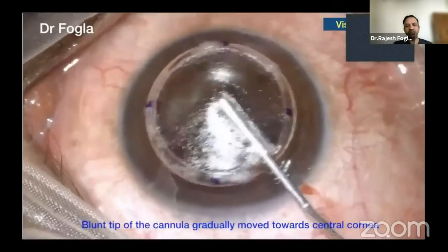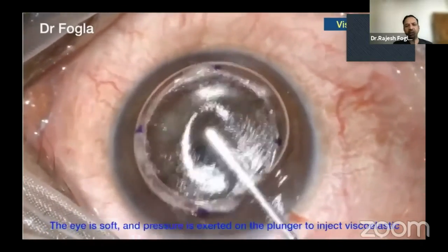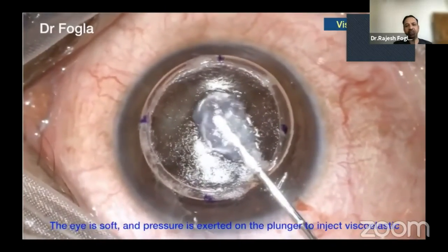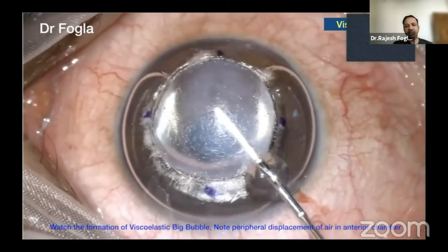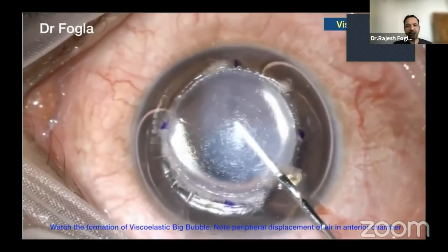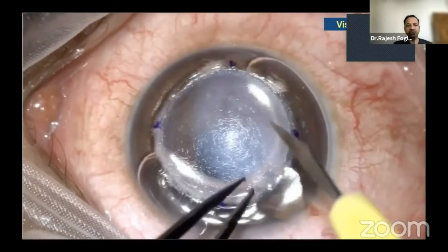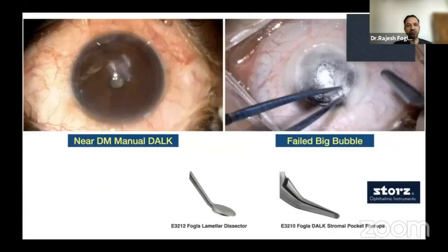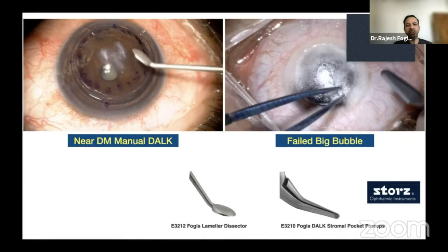The other option is to do a visco bubble. Instead of air, you can put in a cannula at 80 to 85% depth and then inject cohesive viscoelastic to achieve what is called as the visco bubble. In this scenario, it's always better to do a paracentesis first, release some aqueous so that there is reduced counter pressure, which makes it easier to achieve the visco bubble. If you have a failed bubble, you may have to fall back on doing a manual technique.